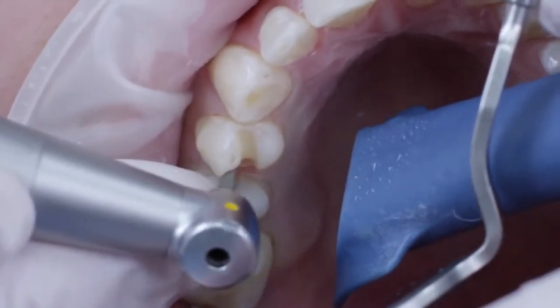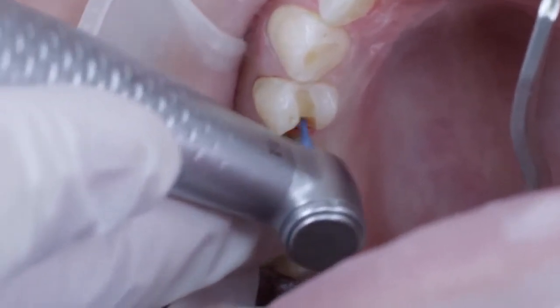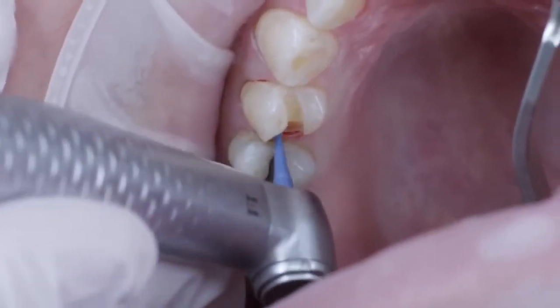This was first performed proximally, then occlusally. The cavity was excavated using a round plastic burr in order not to damage the pulp.